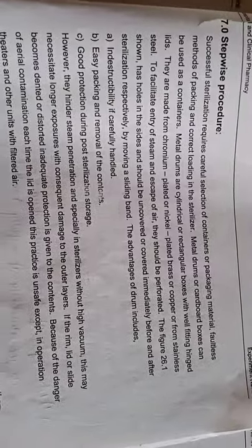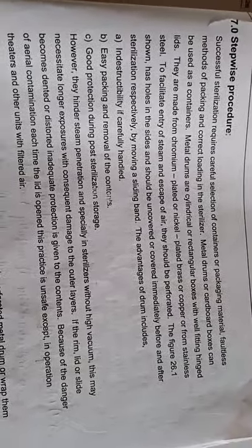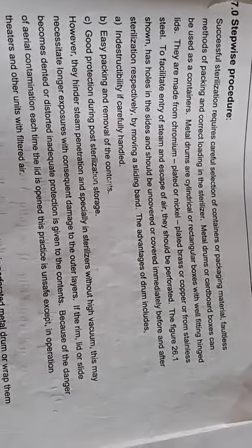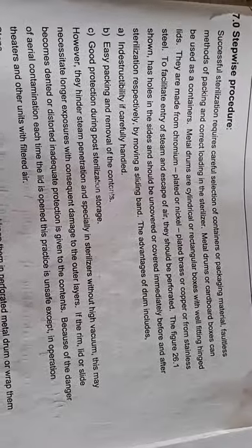For sterilization of surgical dressings, it is very necessary to select the particular type of container to sterilize them. Metal drums or cardboard boxes can be used as containers. The advantage of metal drums is that they are cylindrical or rectangular boxes with well-fitting hinge lids, made from chromium-plated or nickel-plated brass, copper, or stainless steel.